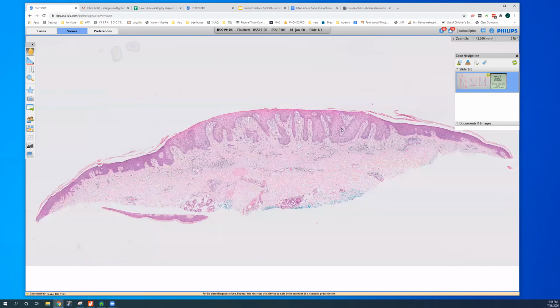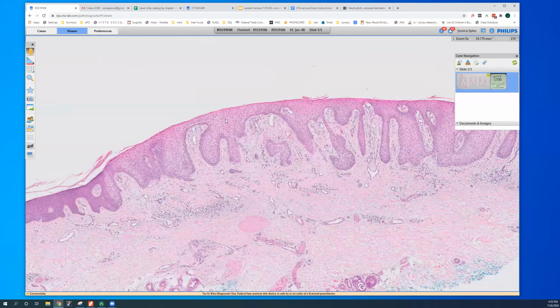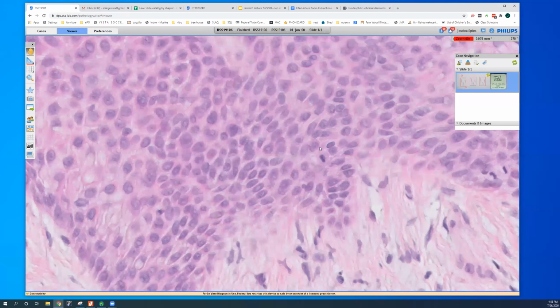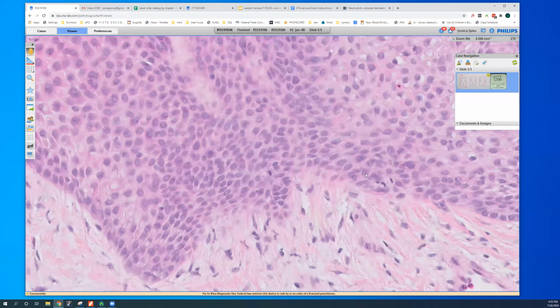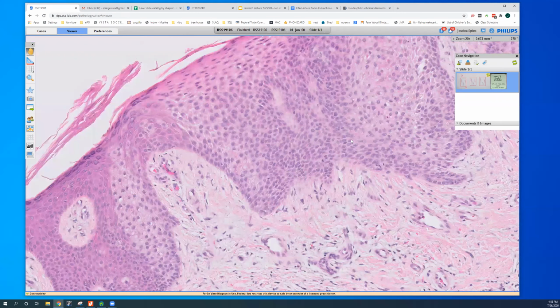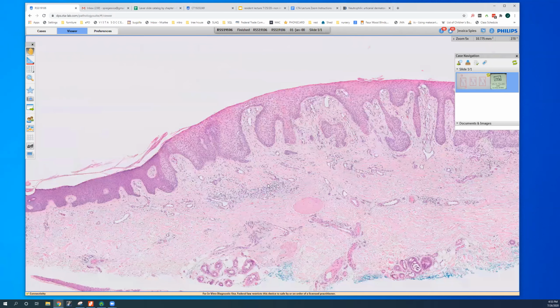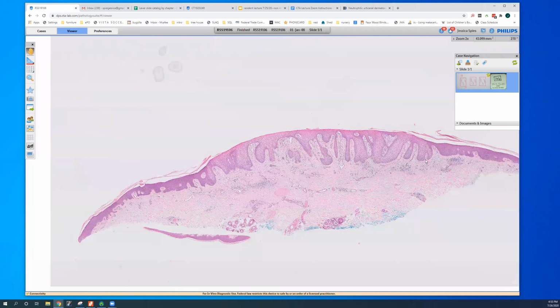Things that you want to think about when you see this epidermal hyperplasia and pallor at low power is there are clear cell variants of Bowen's disease. So you always want to look down at higher power and make sure there's no cytologic atypia of the lesional keratinocytes. Looks like there might be a mitotic figure or two here. Oh yeah, for sure, but that does not make it malignant. And then you might want to think about dermatitis with that kind of pallor. There is a little inflammation. See how well demarcated this is? It really looks like an epidermal neoplasm. Okay.